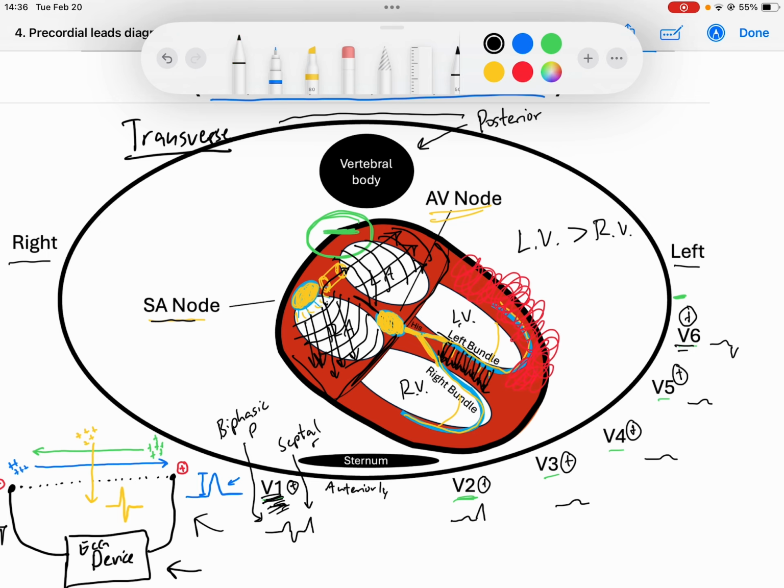And so when we get a wave of ventricular depolarization, the direction of that wave is going to favor the LV. It's going to be kind of generally more forces going that way versus a little bit of forces going this way, relatively speaking, right? And as you could imagine, with more forces going towards the left ventricle, notice that those forces are going away from what? They're going away from V1. And so that causes the rest of my QRS complex in V1 to typically be negative, right?